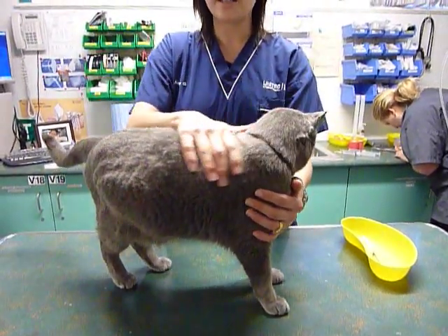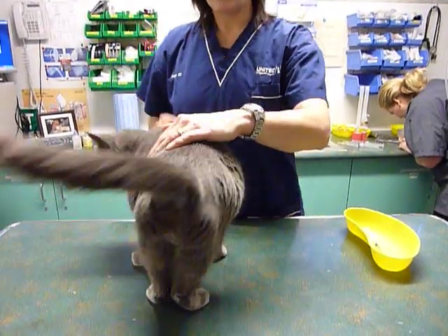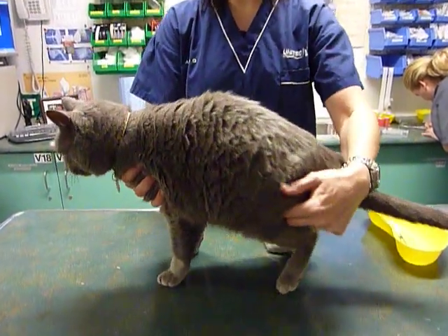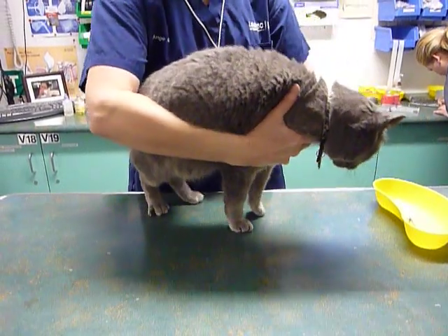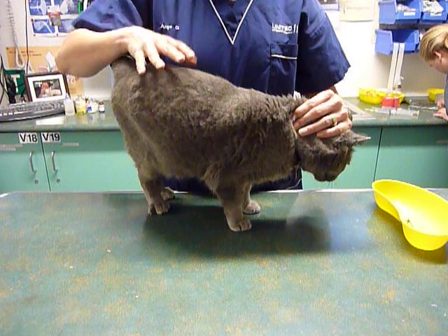We're going to demonstrate a subcutaneous injection in a cat. We're going to position the cat so that your right hand is free and the other hand is controlling the animal.